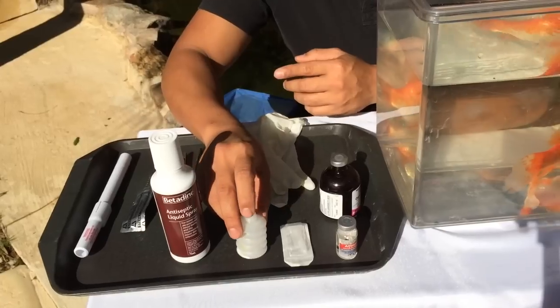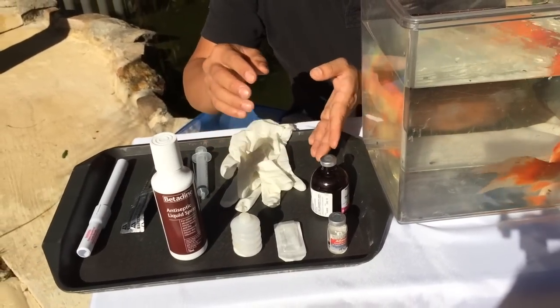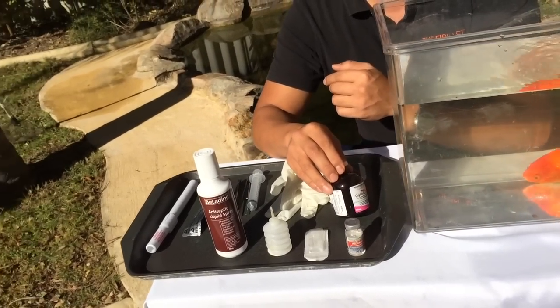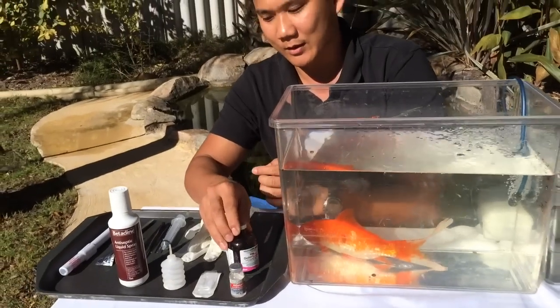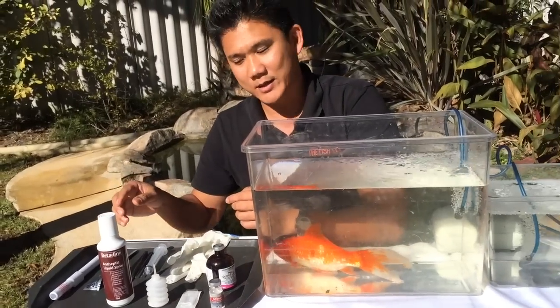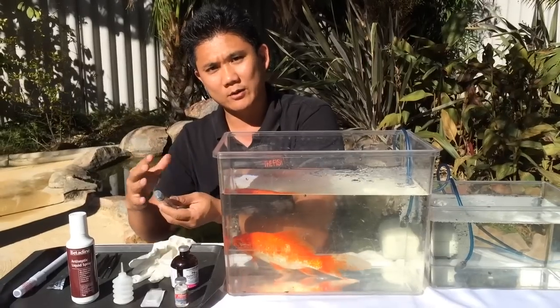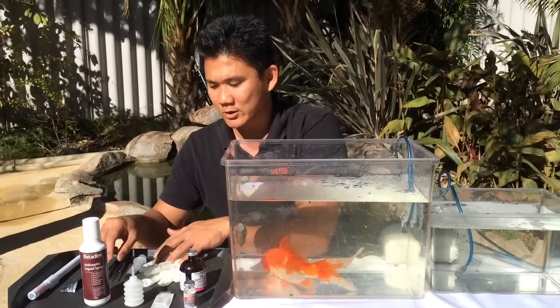So what we've got here is a fish bandage, which is available through our website. As an antibiotic, just to make sure we keep bacteria away from the wound, we've got some long-acting oxytetracycline. We're going to have a syringe to help with irrigating the gills and maintaining moisture throughout the fins and the body throughout the surgery.